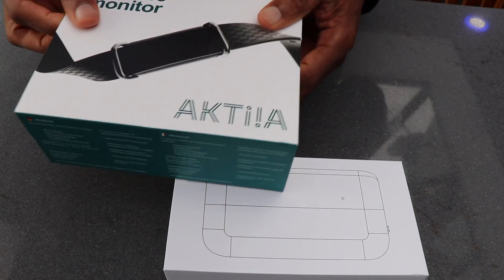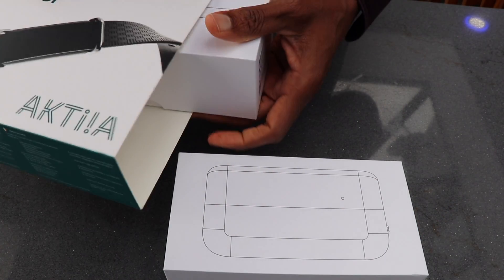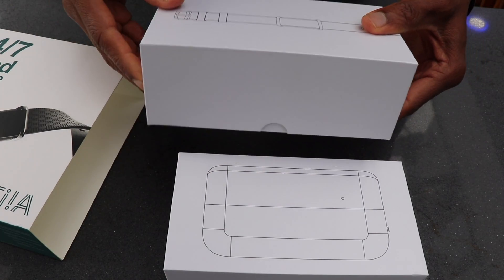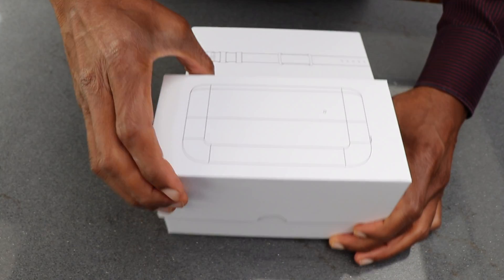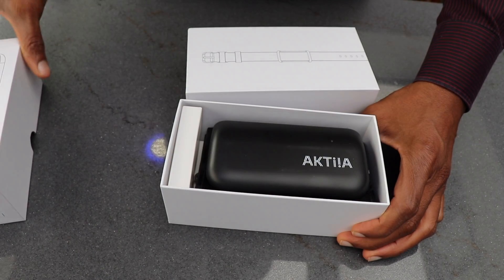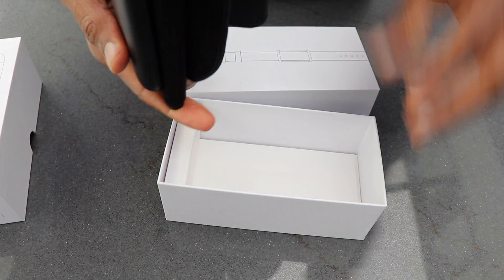Inside the pack you have two boxes — one for the wristband and the other one for the cuff. Here's the cuff. The cuff has no display on it and it syncs with the wristband.